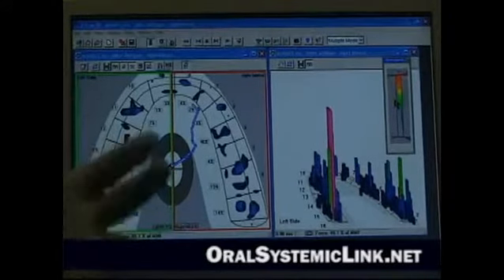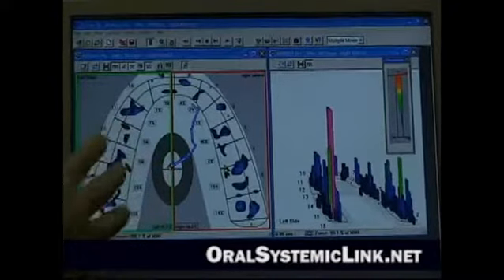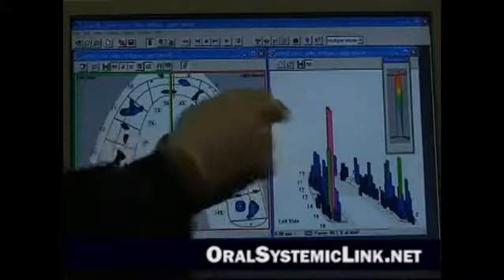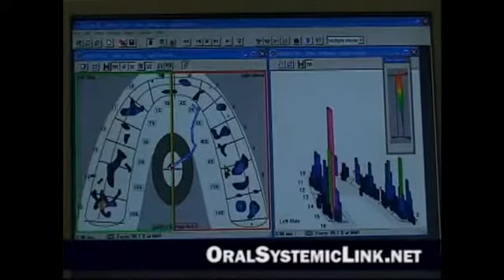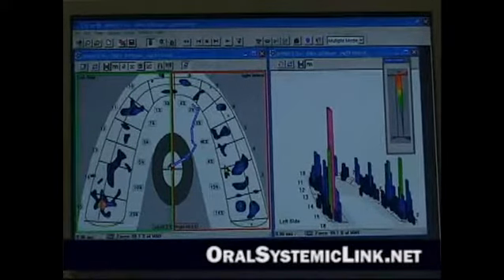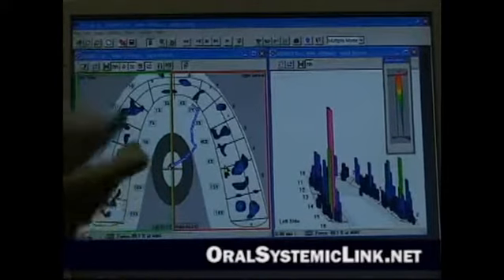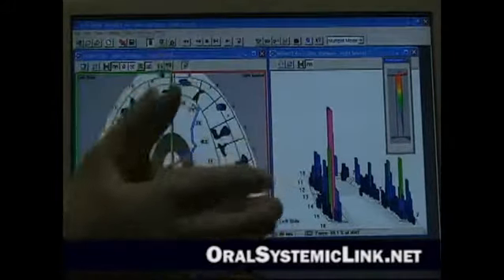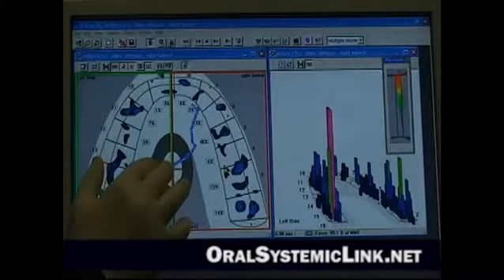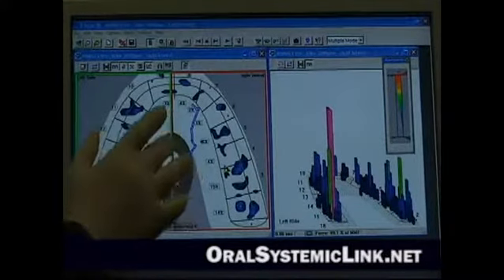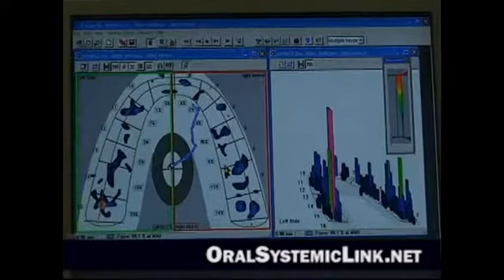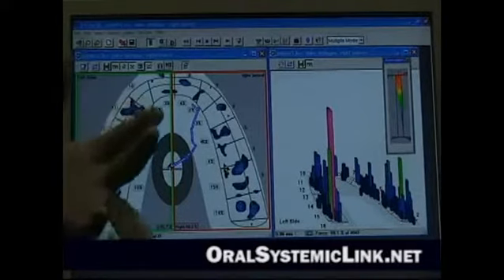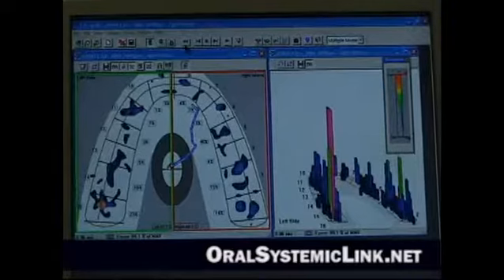On the other side, we break it down into a two-dimensional view, a little more like articulating paper. We can see the same high-force marks, and we've got tooth numbers along with a left-right percentage. For example, your bite as you're completely closed shows 52% on one side and 48% on the other — that's pretty good. The main thing you're looking for is to have the center of force icon be inside the target. Then we look at the dynamics of how you bite.